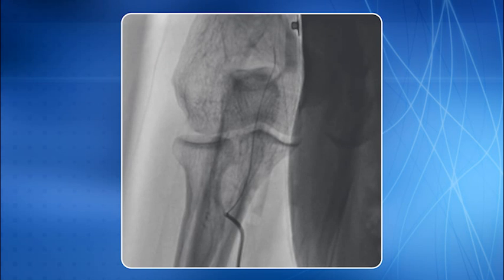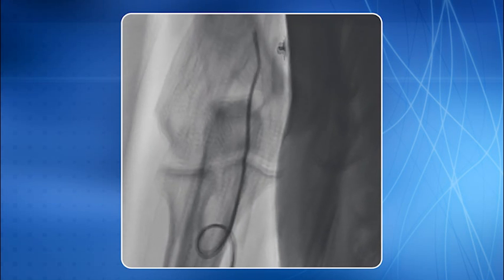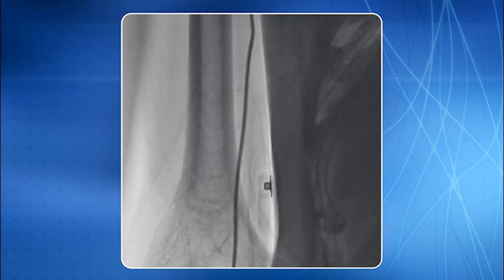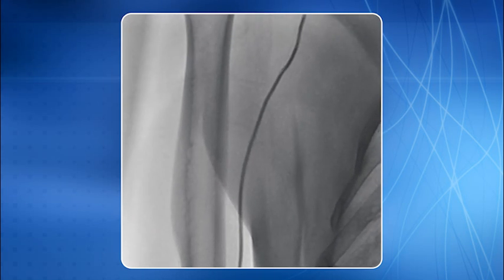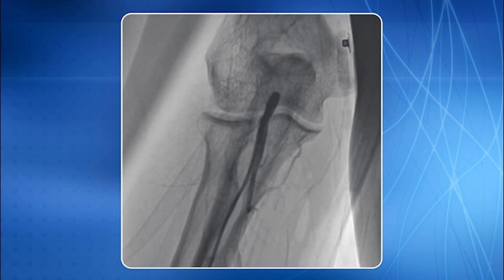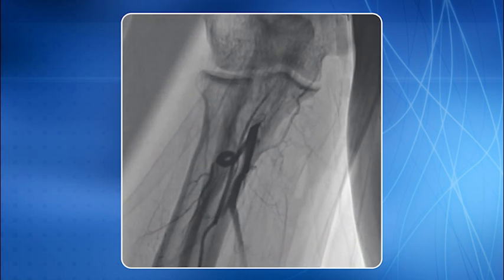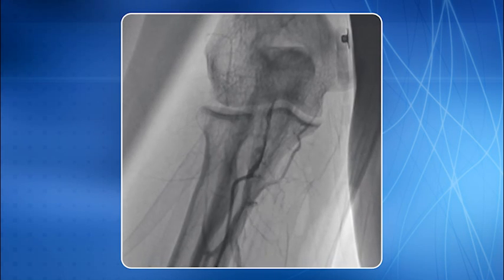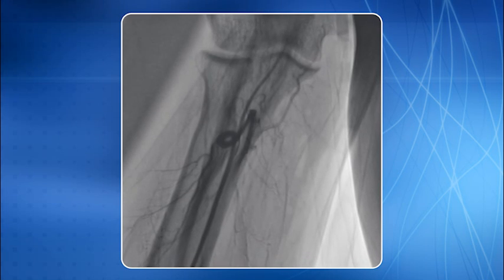The OptiTorque TIG catheter has been negotiated over the wire across the loop without any resistance, which is so obvious on this angiogram. If there is no resistance to the movement of catheter and wire distal to the loop, the procedure should be continued in usual fashion. Once the procedure was done, while coming back, we have documented the loop. Note that there is no injury in this region.